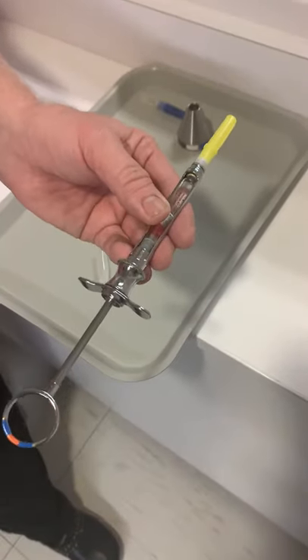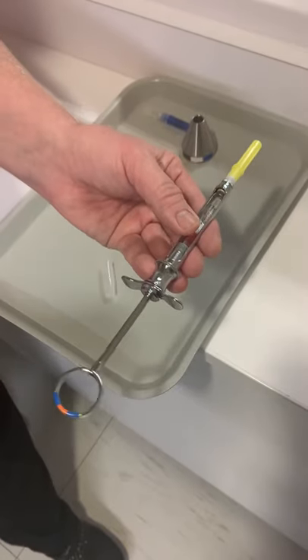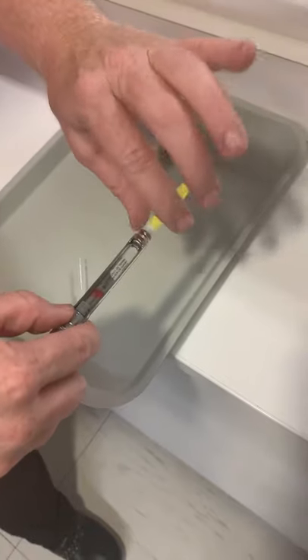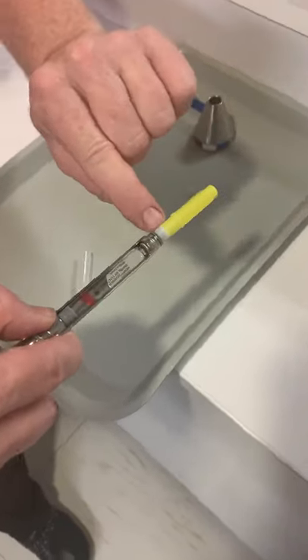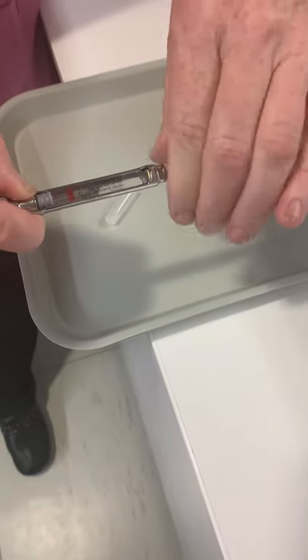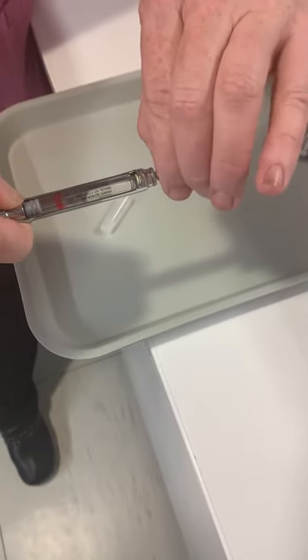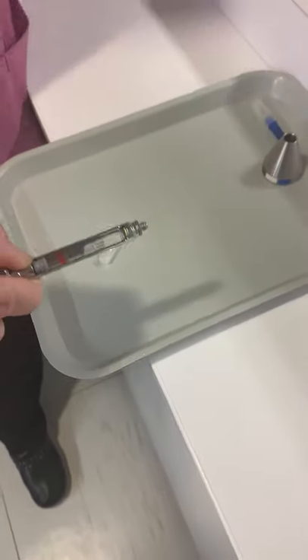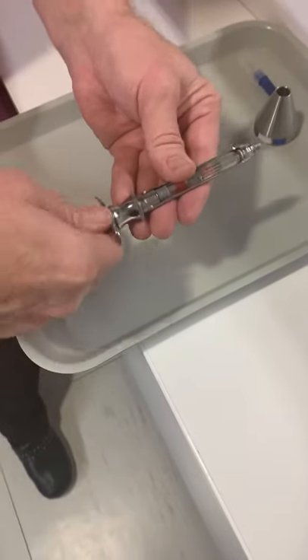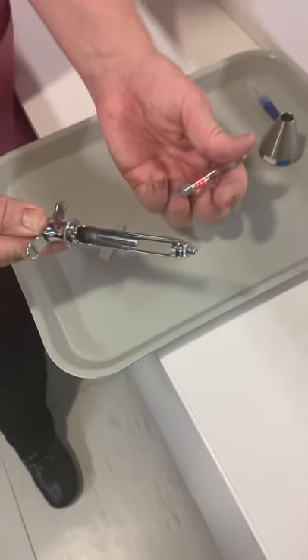That's the setup. Now after the injection has been given, we want to remove the needle — grab it where the cap and the hub are together, twist the needle off, and pull straight out. That drops into your sharps container. Then pull back on the thumb ring to release the harpoon and dump the carpule out.